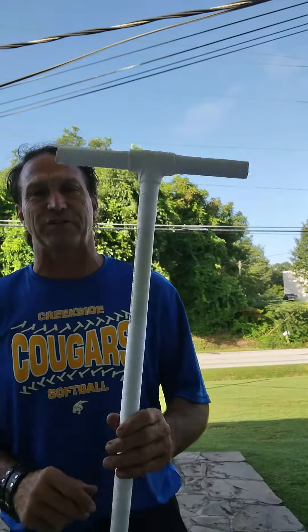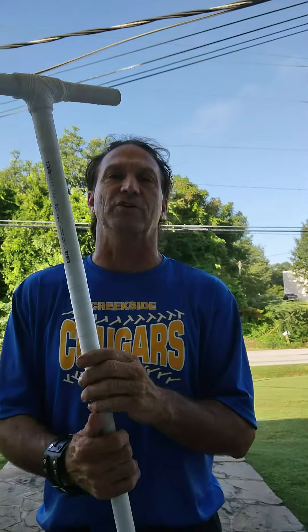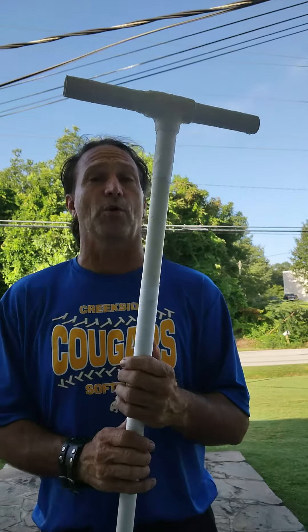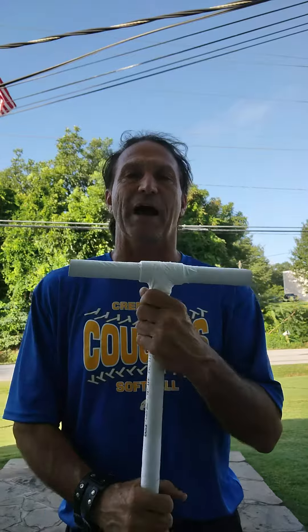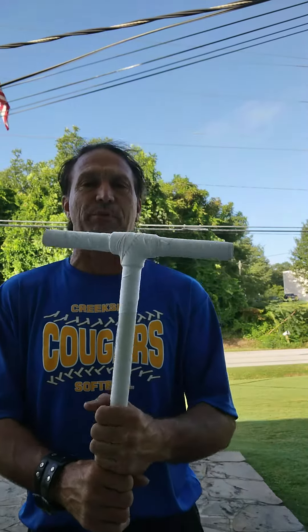God bless you. Here is a physical therapy stick. You can use this to work on your shoulders, but don't do anything different or opposite of what your doctor or therapist would tell you.